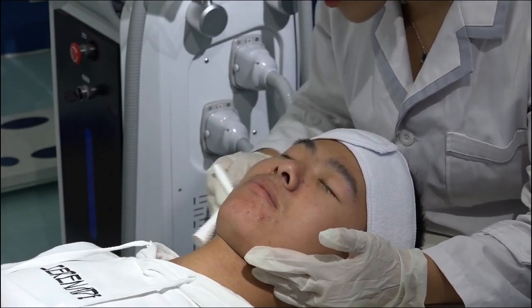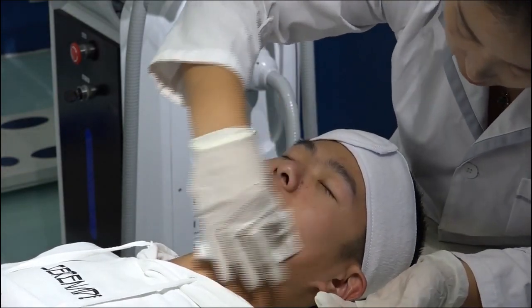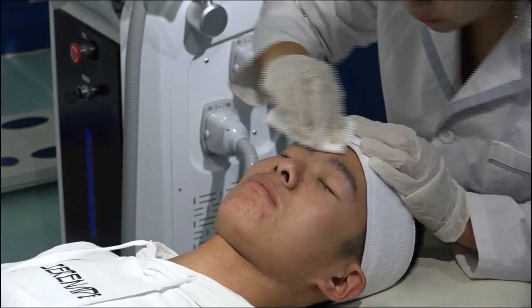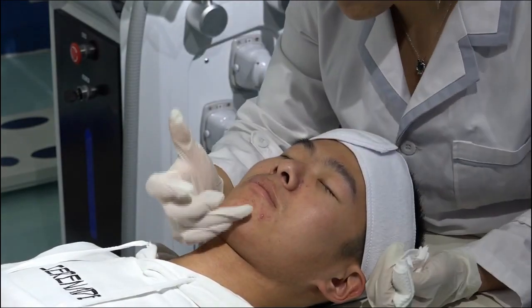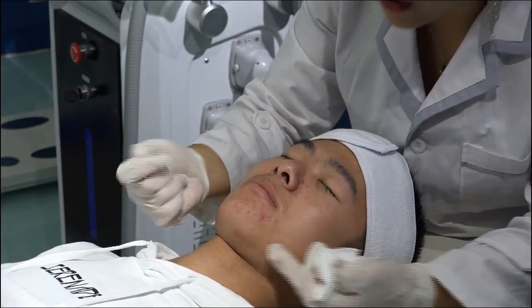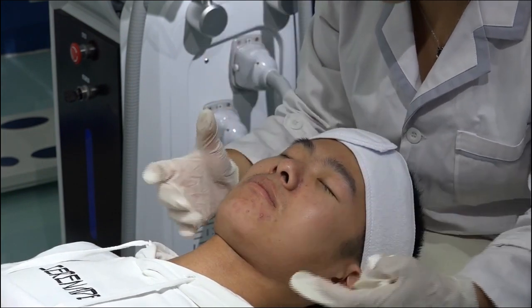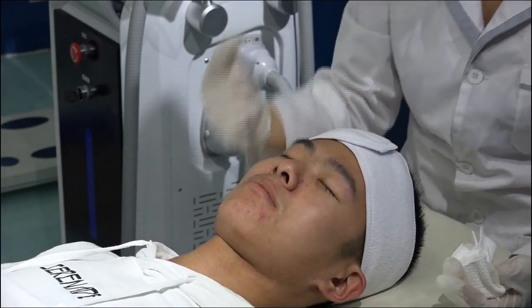If you also have a beard, we need to shave the beard here to keep the treatment area better for the treatment today. Okay, this is the first step, cleaning.